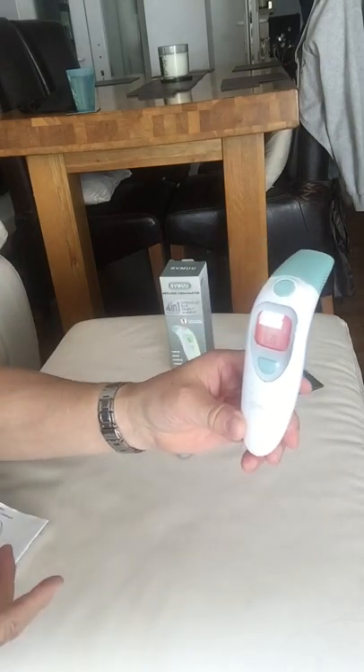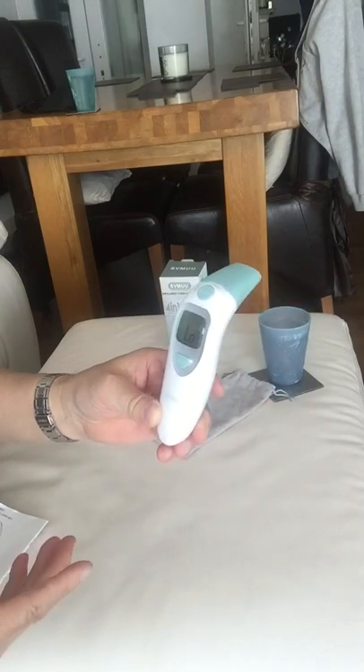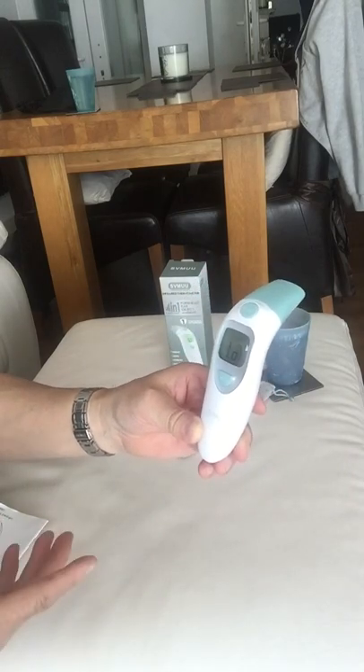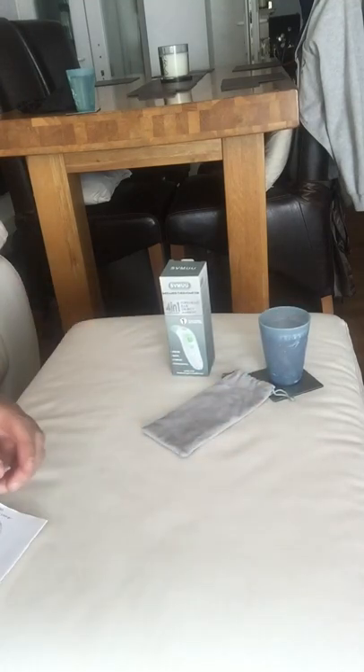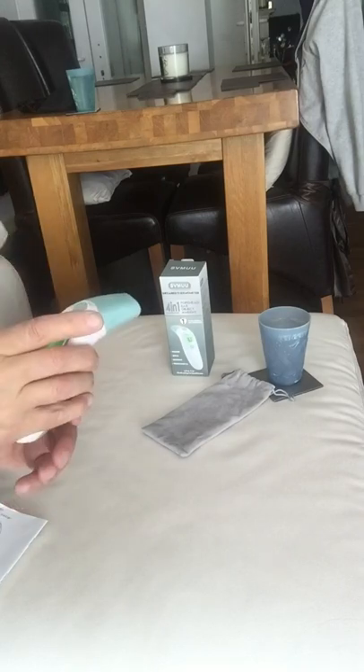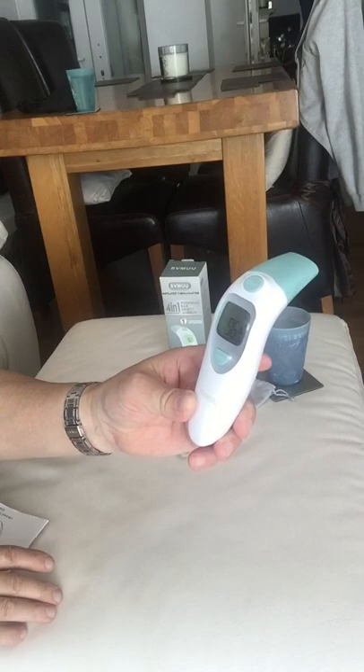You'll hear two or three beeps that tell you it's measured correctly. I've got a low sign, which means I did it incorrectly — it wasn't up against my forehead correctly and I didn't get a good reading. I'll try again. There you are — I've got a long beep and I've got 96.9 on my forehead.